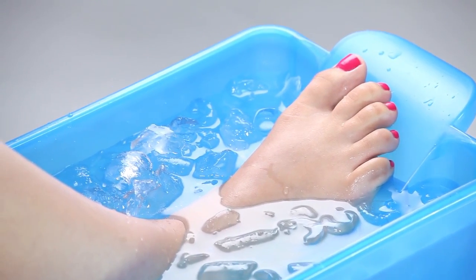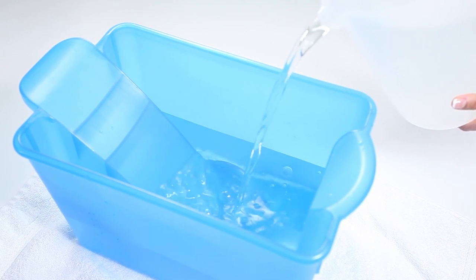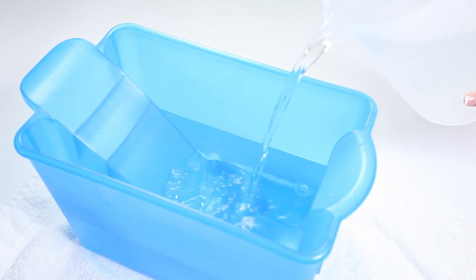Ha ha ha ha, beautiful. For heat therapy, just pour hot water of 110 degrees or less to the desired fill line. Just look at that baby's shine.